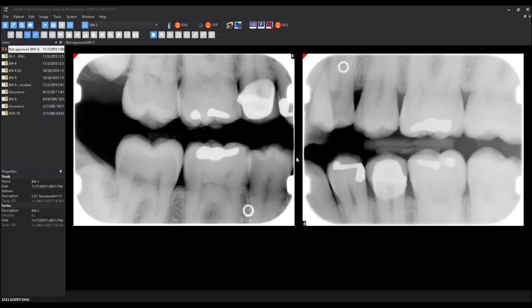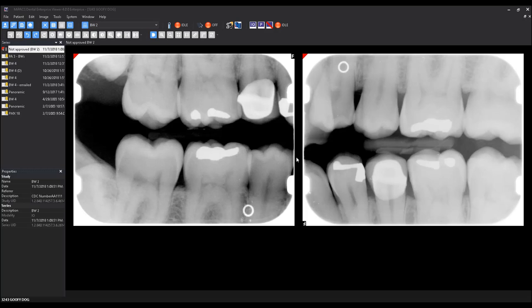DICOM images can be imported into MyPax as well. Since DICOM images already contain patient information, you do not necessarily need to have a patient open prior to importing. However, if the DICOM images came from another system, there is a good chance they will not have the most current patient information. Because of this, we encourage you to have the correct patient open prior to importing.